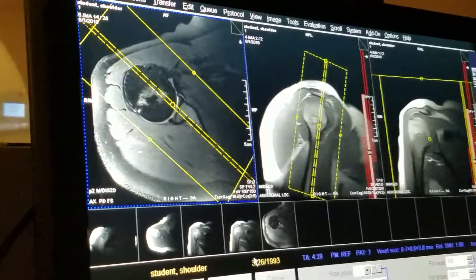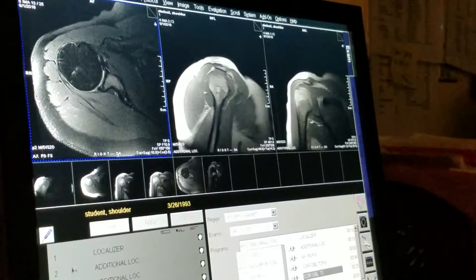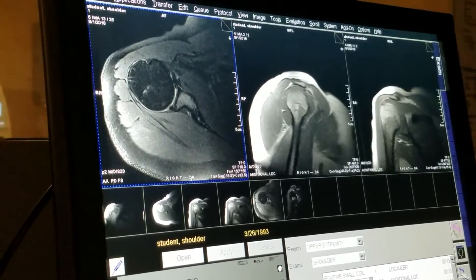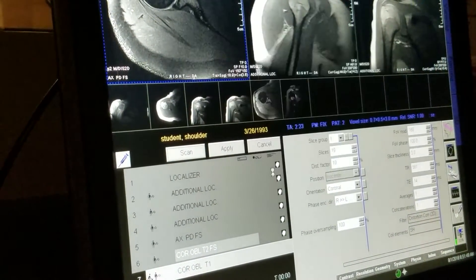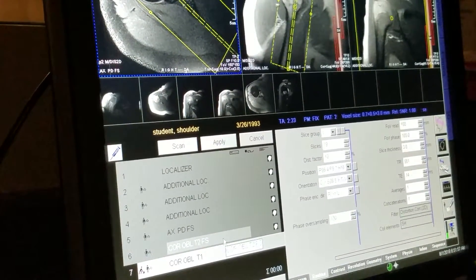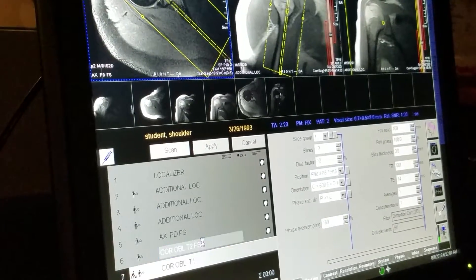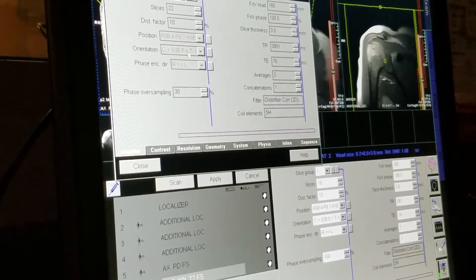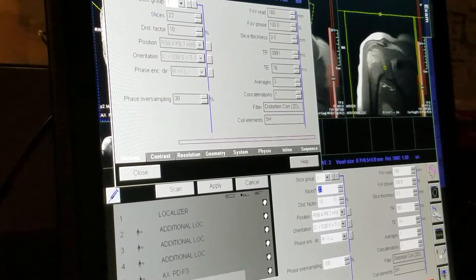And that's it. This scan is going to run for four minutes. So while the coronal oblique T2 is running, we're going to copy our coronal oblique T2. Occasionally, depending on the scanner, the slice thickness and distance factor will be different for shoulder imaging, so I always copy to the default first. Then double-click the coronal oblique T2s and see what these are at — so these are at 3 skip 10%. These are also 3 skip 10%, so here we can change these to 22 slices to match.